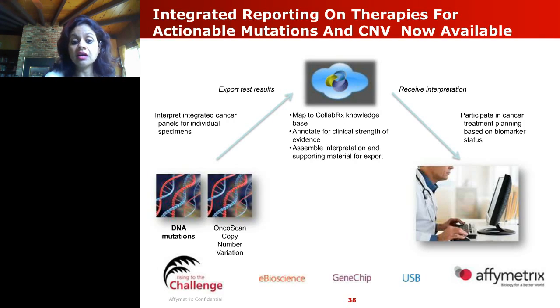However, when the samples are very heterogeneous and contain too many clones, then to assign a single genomic tumor burden value across the sample is not possible, and there you get a fractional call that represents the average copy number between the tumor and the normal portion. What our users do is, if they have an independent estimate of tumor burden from a pathologist, we have a tool where they can put in that tumor burden estimate in the calculator and can therefore still arrive at the copy number estimate in the tumor portion only.